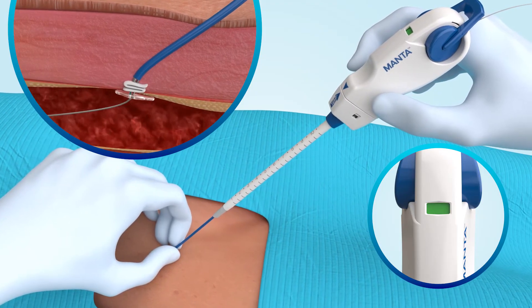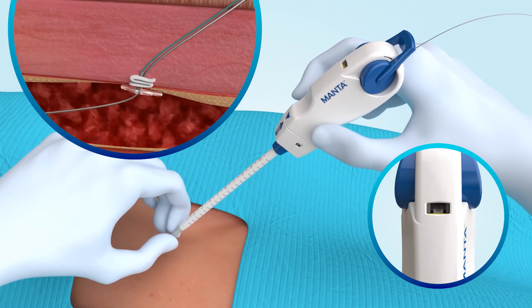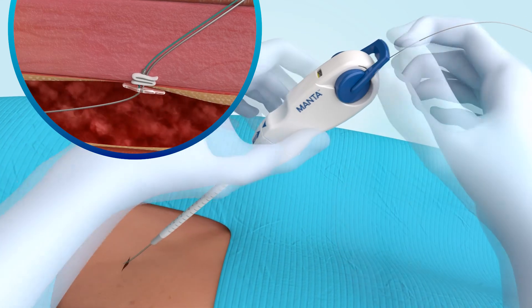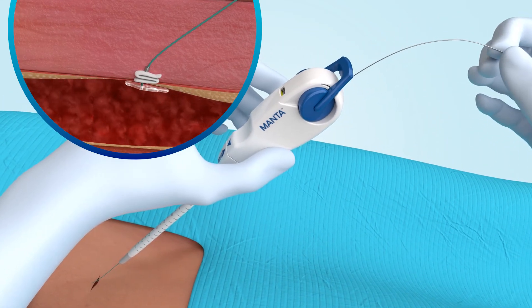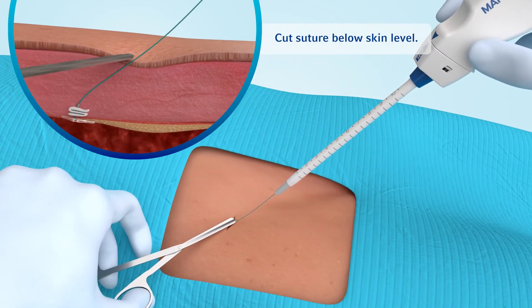The lock advancement tube may be retracted to assess hemostasis. Once hemostasis has been confirmed, remove the guide wire. The suture should be cut below skin level.